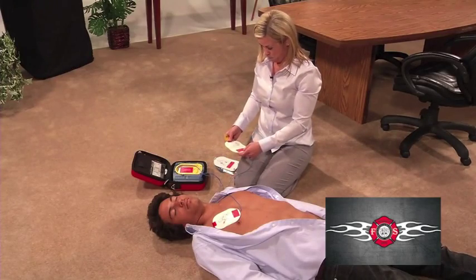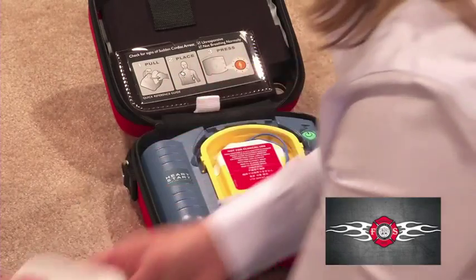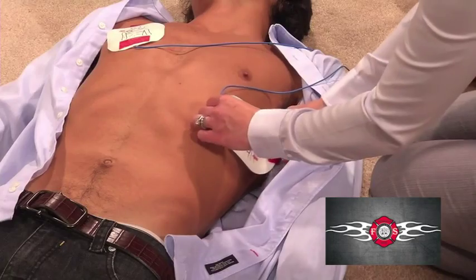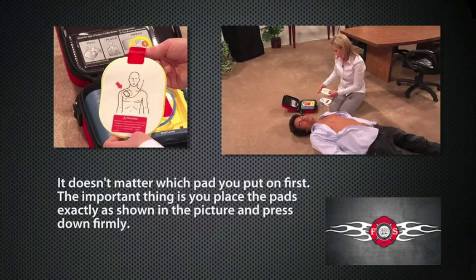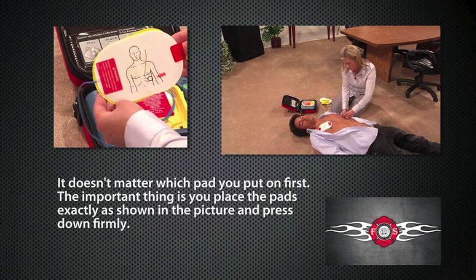When the first pad is in place, look carefully at the picture on the second pad. Press pads firmly to the patient's bare skin. It doesn't matter which pad you put on first — the important thing is that you place the pads exactly as shown in the picture and press down firmly.